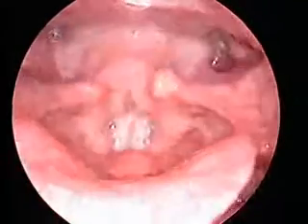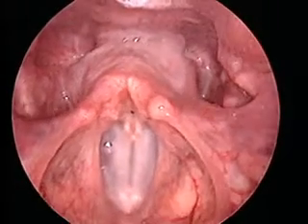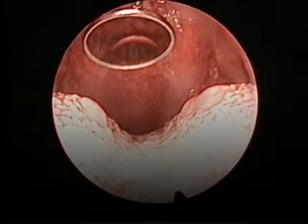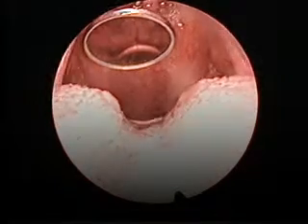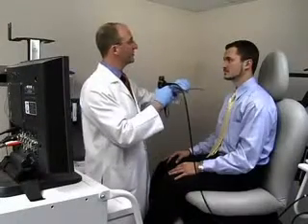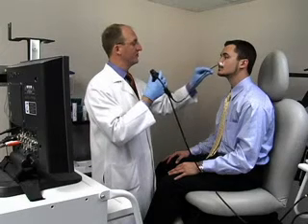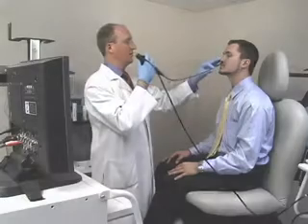Visualization of the larynx and pharynx is an essential part of a complete head and neck examination. Although the location of these structures often precludes direct visualization, simple techniques can be used to evaluate these anatomic structures in the clinical setting. Indirect laryngoscopy can be performed with either a simple dental mirror or with a flexible fiberoptic endoscope. These procedures can be performed on patients who are awake and cooperative and are usually well tolerated.